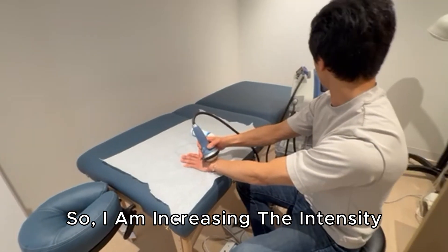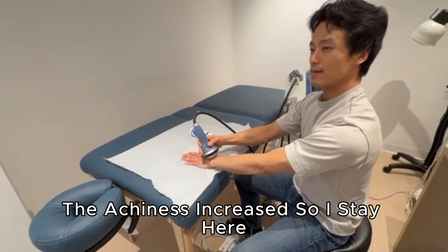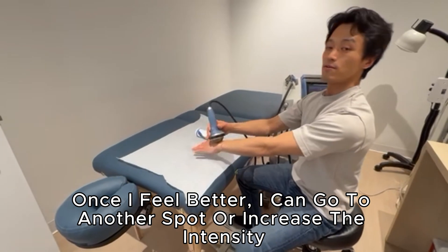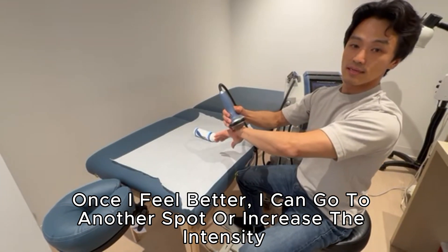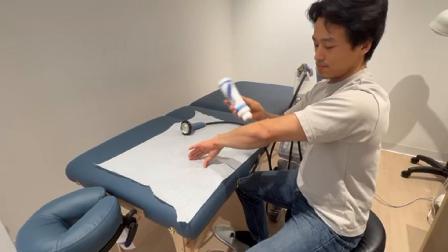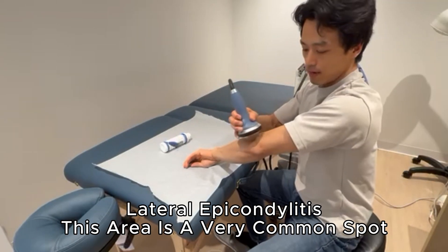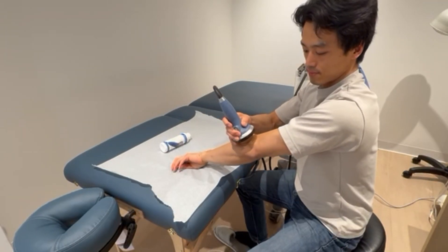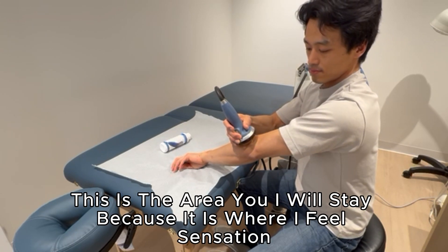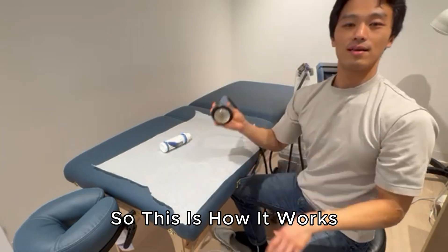I'm going to increase to intensity 3, then 4. I feel the achiness increase, so I stay over that spot. Once it feels better I move to another spot or increase the intensity again. I can also go to the elbow — tennis elbow, lateral epicondylitis, this area. It's a very common spot. I feel it here, so that's the area I stay on. This is how it works.